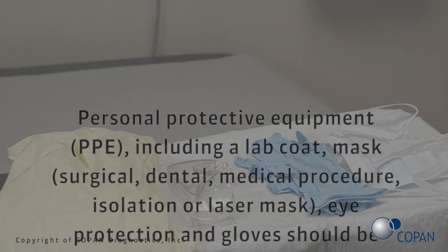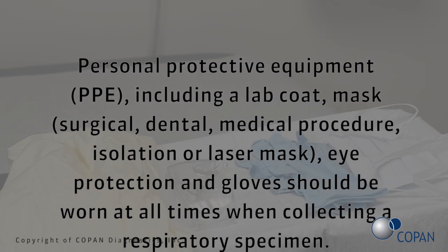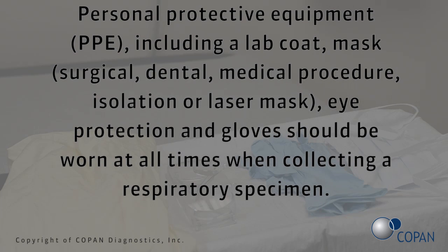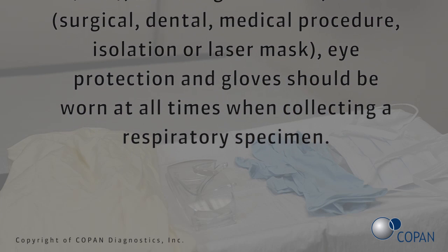Personal protective equipment, PPE, including a lab coat, mask, surgical dental medical procedure isolation or laser mask, eye protection, and gloves should be worn at all times when collecting a respiratory specimen.